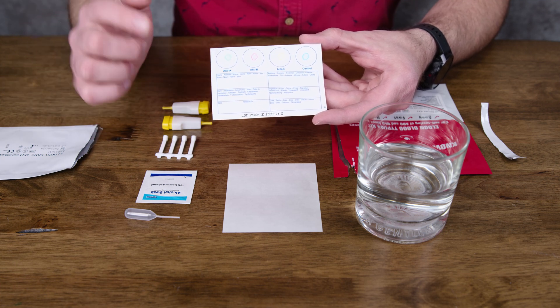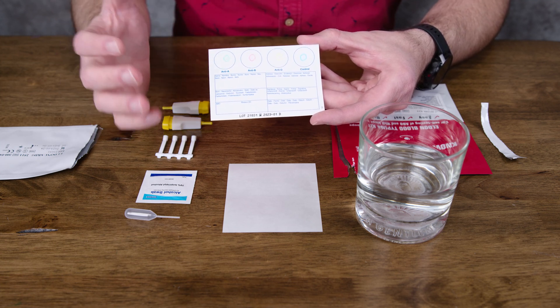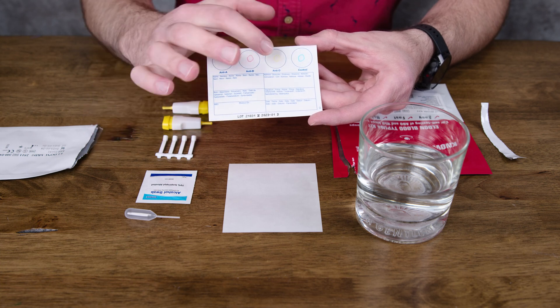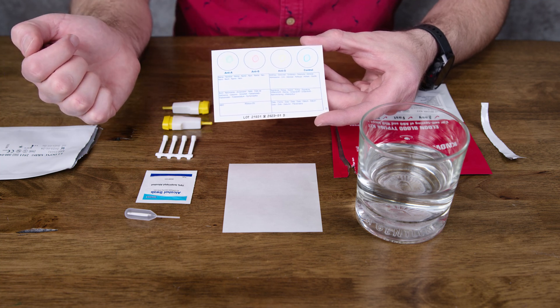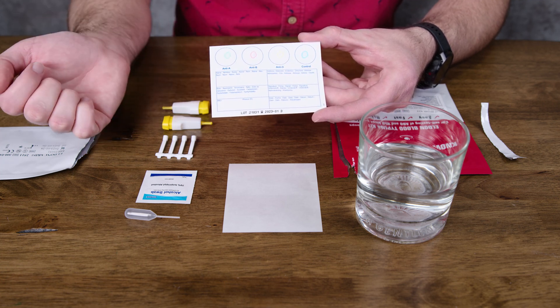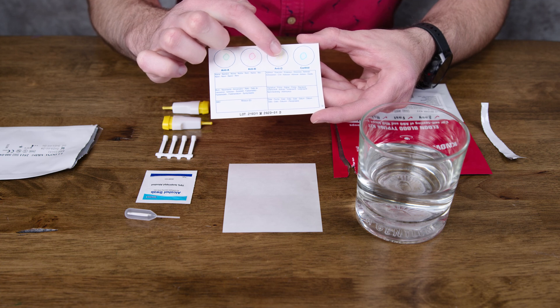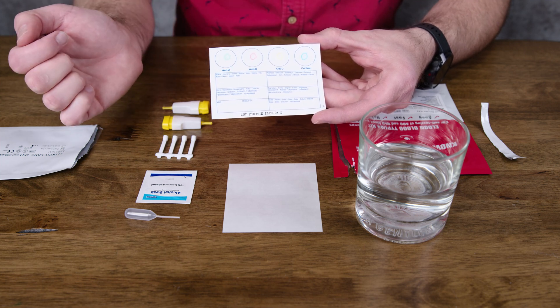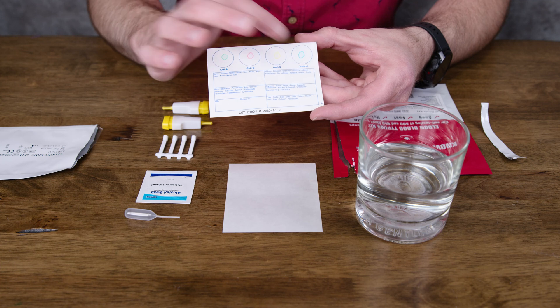Let's talk about what this would look like for each blood type. If the A clumps up, then you have type A. If the A and the B clump up, you have type AB. If the A doesn't clump up but the B clumps up, that means you have type B. If neither of them clump up, then you have type O because there wasn't A or B present. If the D clumps up, that means you had RH present — so if it clumps up, you are positive. Mine will be: A clumped up, nothing for B, and the anti-D clumped up, meaning I am A positive. The majority of humans are positive. And the control — there should definitely be no clumping, because there's nothing there.